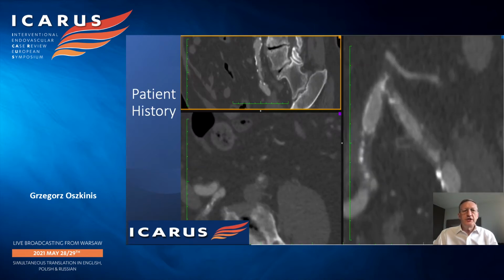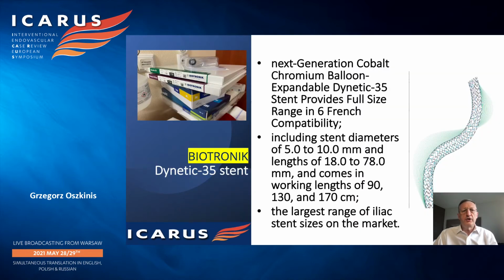On the CT, we saw the lesions, calcified lesions in common iliac artery. And because it was the common iliac artery, we decided to do the procedure from the radial approach.